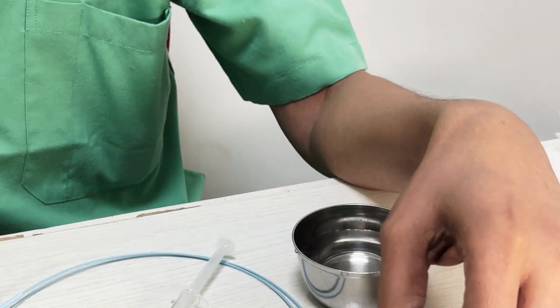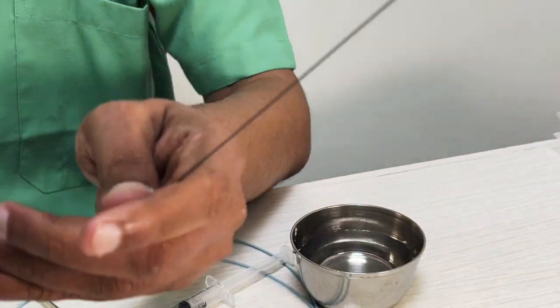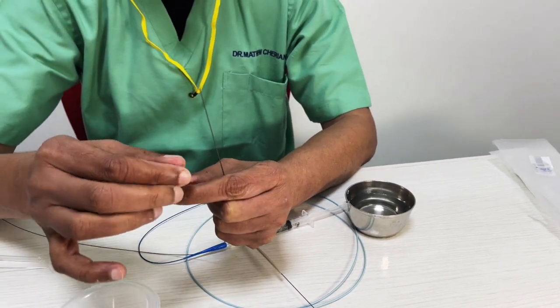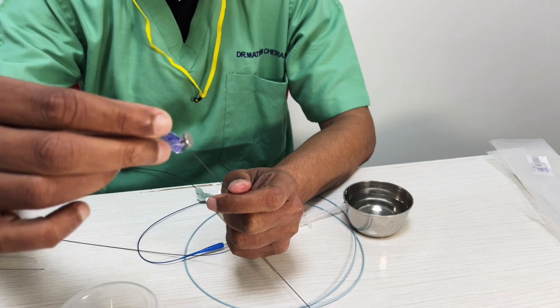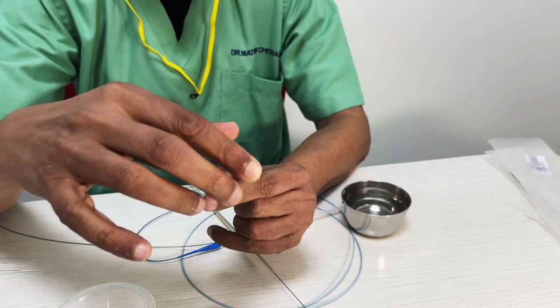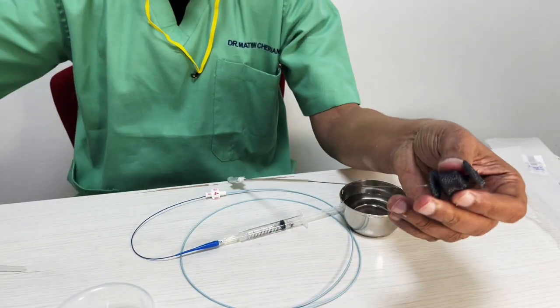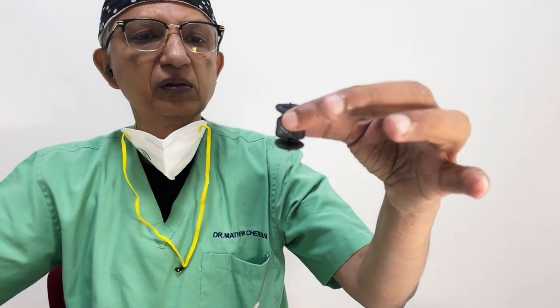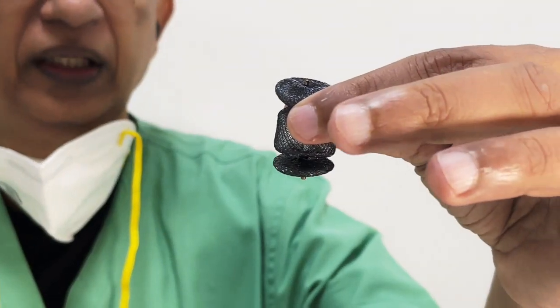Let's bring that up. On the hind end of this, you will take this and you just connect this and just tighten this, that's all. Once you tighten it, you can easily take it out. Even if I do it here, I don't know if you can see this. Can you see what's happening? And it comes off, right? So did we waste it? No, you did not waste it because technically you can screw it back also. You can just put it back.